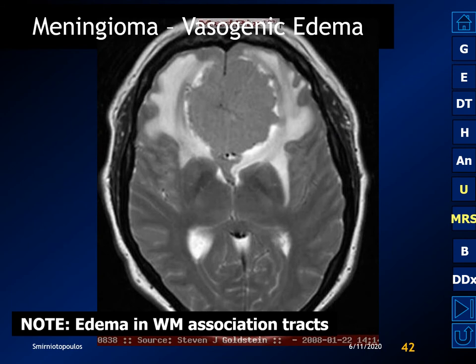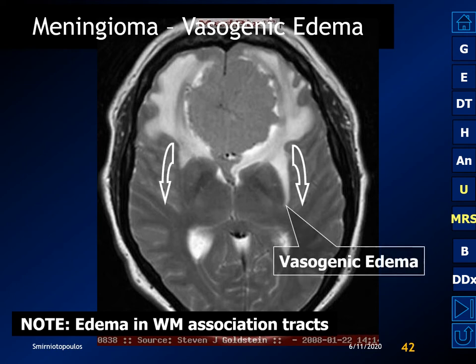Here's an example of a bifrontal meningioma extending on either side of the falx cerebri, and we can see how the vasogenic edema is extending along the association fiber tracts and along the external capsule. Notice that the gray matter is still intact with its normal signal intensity.